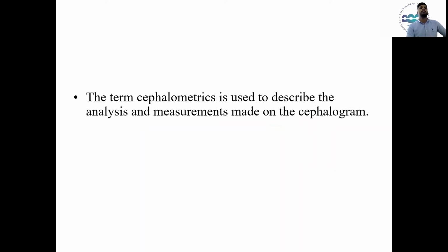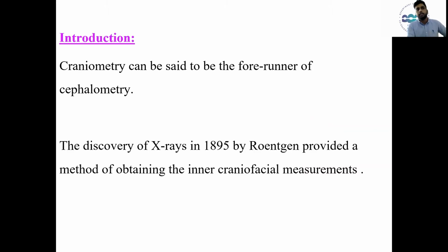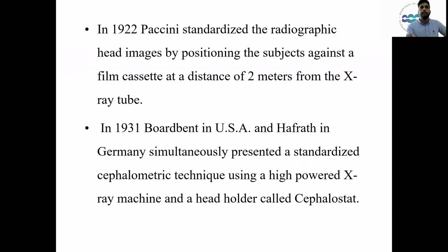From the Department of Orthodontics and Dentofacial Orthopedics, we'll discuss cephalometrics in detail. The term cephalometrics is used to describe the analysis and measurement made on the cephalogram. Coming to the introduction, craniometry can be said to be the forerunner of cephalometry. The discovery of X-rays in 1895 by Röntgen provided a method of obtaining inner craniofacial measurements.